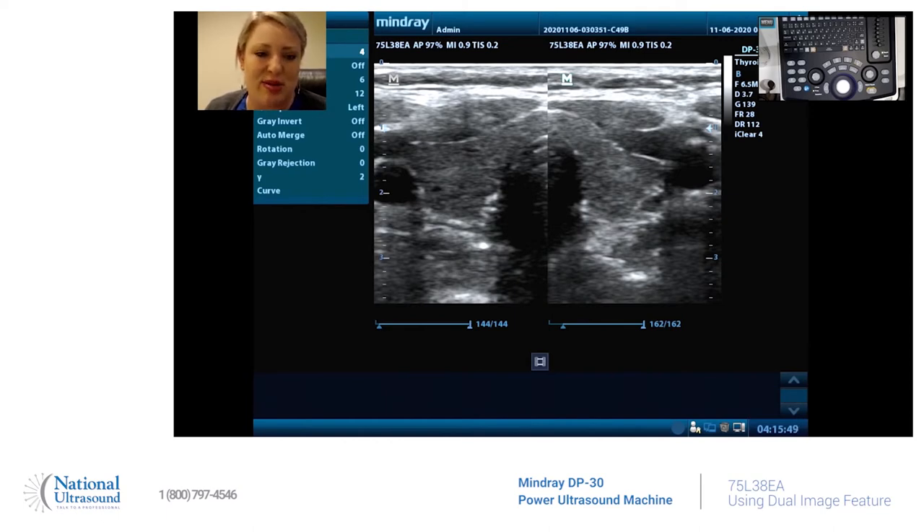This machine comes with a linear probe and a curvilinear probe. I wanted to show you guys the spectacular usage of dual screen and how easy it is to maneuver and optimize your image.